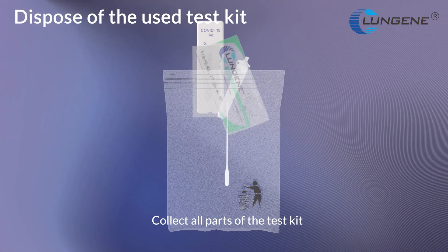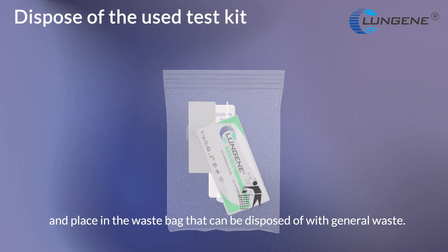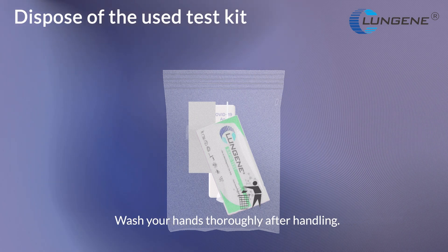Collect all parts of the test kit and place in a waste bag that can be placed in general waste. Wash your hands thoroughly after handling.